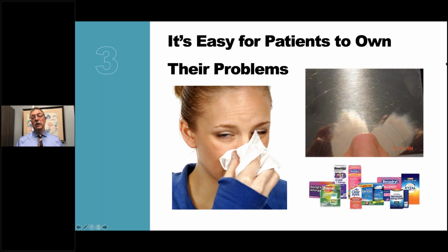That's a conversation piece. Is that scientifically important? Well, not so much, but you can use that in conjunction with your exam, with your history, with perhaps your cone beam x-ray that looks inside the nose. And you can say, wow, that left side just really doesn't work that well, does it? If that's the case for your patient. And they don't know that because they just breathe in. They don't think about left and right.